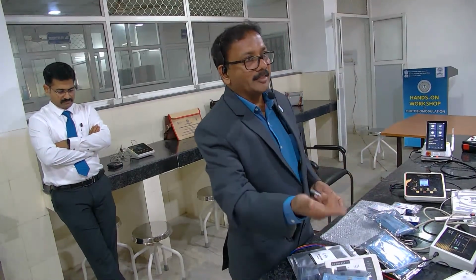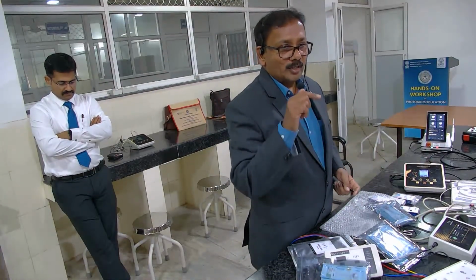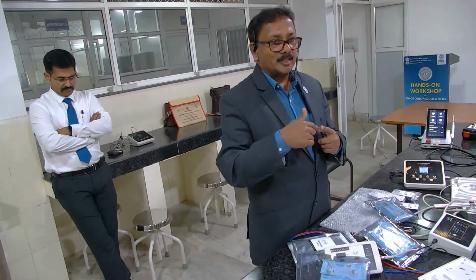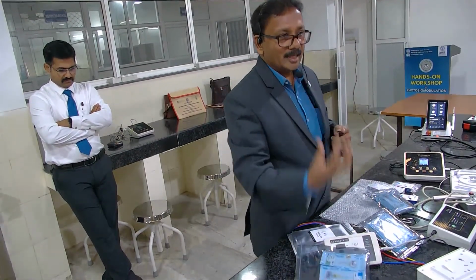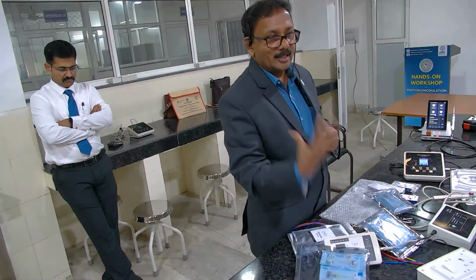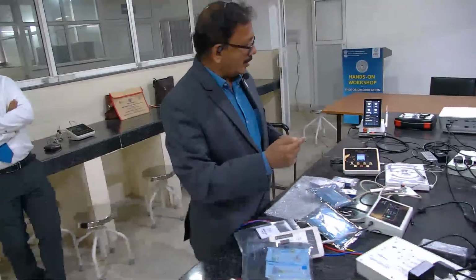You are not keeping the laser exactly at the apex, you are keeping it at least 2 to 3 millimeters short so that the laser's energy reaches the apex. In case of a sinus, don't use only the laser tip.